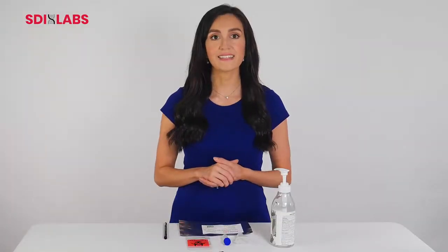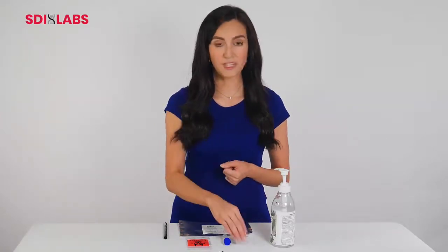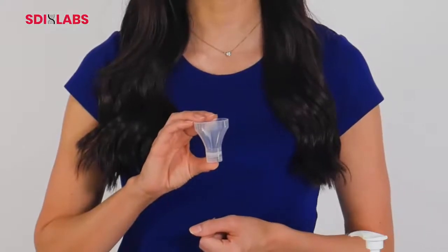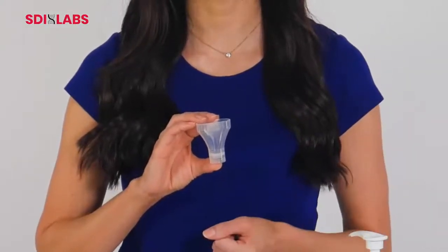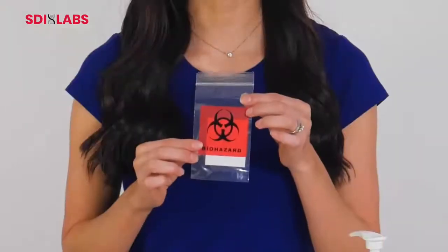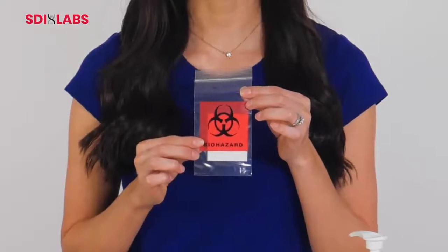The SDI saliva testing kit does not require any painful or inconvenient swabbing. The funnel will be the only necessary tool to help give your sample. The kit also contains an included biohazard bag to ensure proper handling after you take your sample.